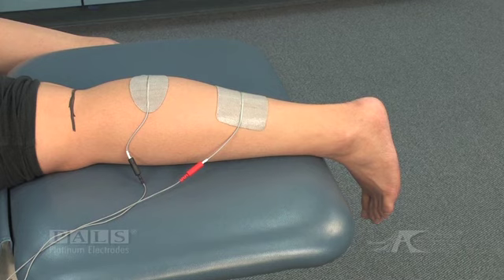The proximal electrode is placed over the origins of both the medial and the lateral gastroc. The distal electrode is placed over the soleus, where it is exposed.